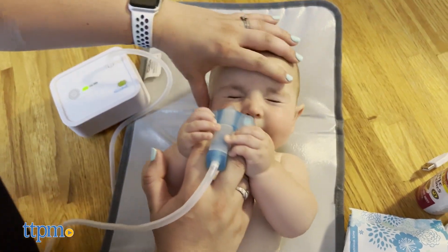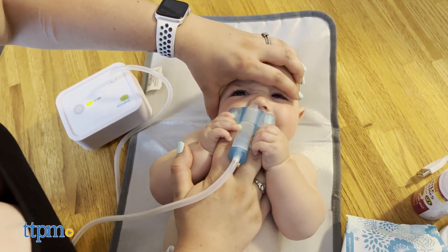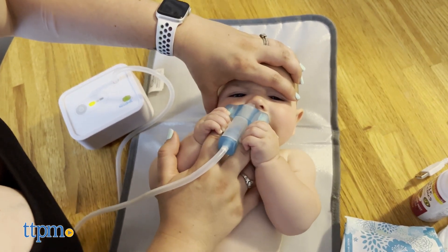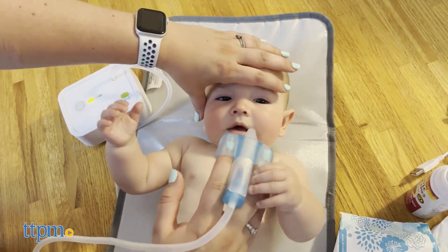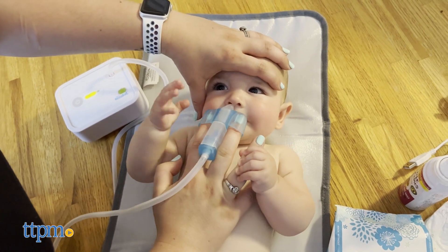When using the Nosebot on Riley, I wasn't sure if I liked it because it took over 12 hours just to get half a charge. If I needed to suck the boogers immediately out of his nose, I'd have to use a bulb sucker. The sound it made when you turned it on was also very noisy, and it did kind of scare Riley. I stayed on the first level of suction, and he barely liked that, so I was honestly afraid to go to the next level.